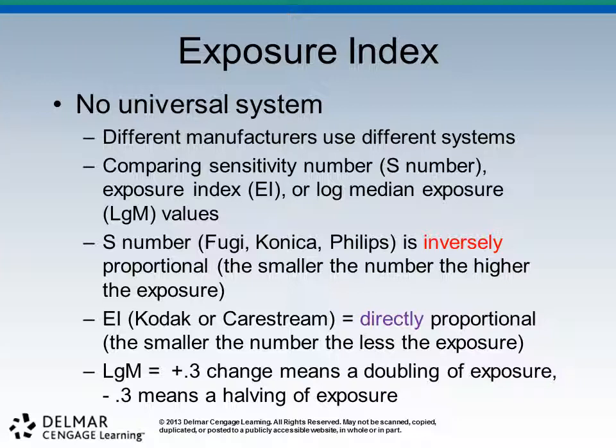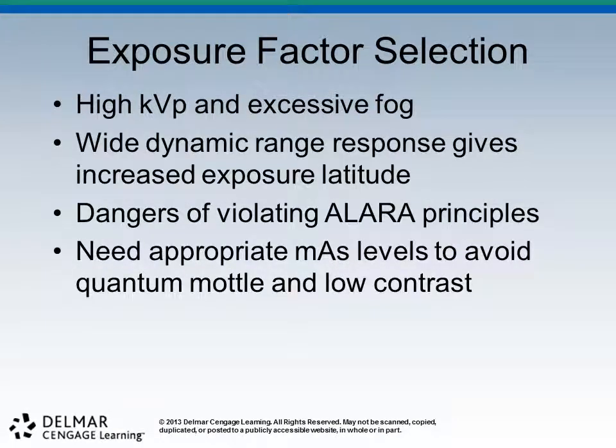See, all of these are measuring exposure, not necessarily density, because if you remember, density is a function of the software. Okay? So that's really as deep as I want to go on these for now. Remember the three, remember inverse, direct, and remember that 0.3 change is a doubling or halving of exposure on log mean. Cool? All right.